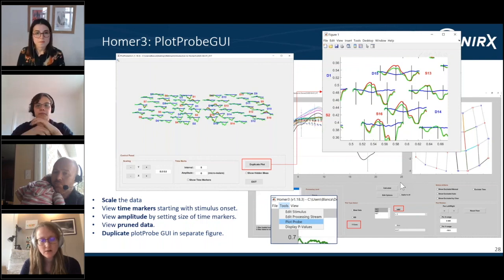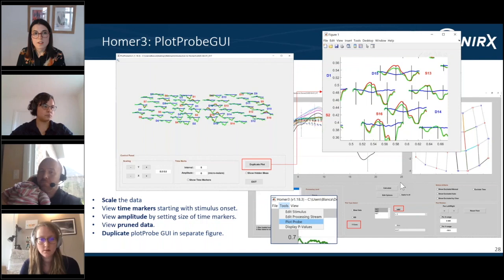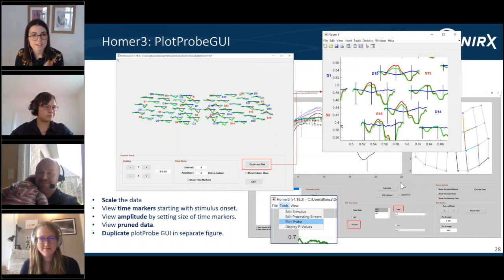I have a question here. How does the pre-whitening operate when you chunk a segment of the data? Does the algorithm consider that the correlation is broken between different segments? I will let Ted answer that if he's able to.